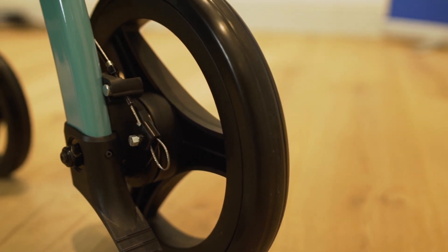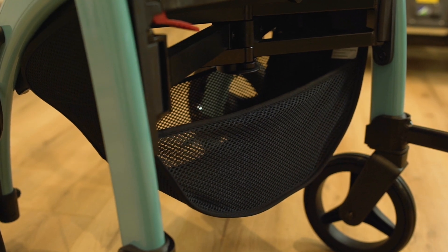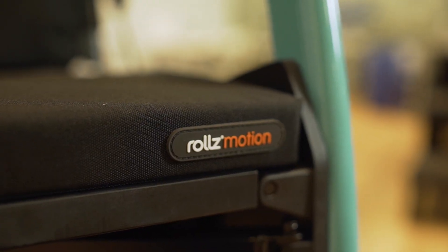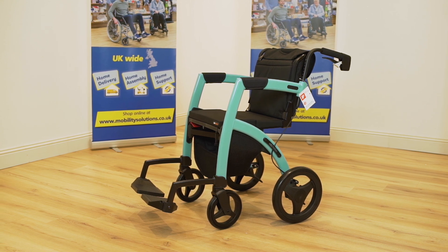With a range of colors and optional accessories to choose from, you can find the right Rolls Motion 2 for you. The Rolls Motion 2 comes with a five-year warranty on the frame, and with Mobility Solutions' dedicated aftercare team, we can take care of you every step of the way.